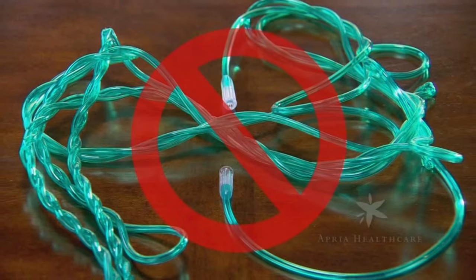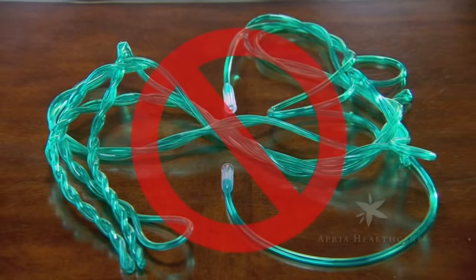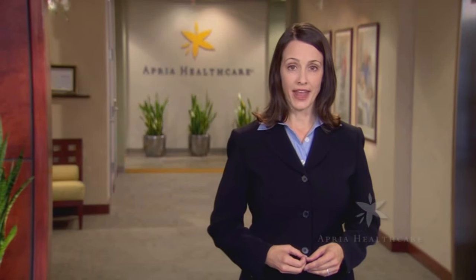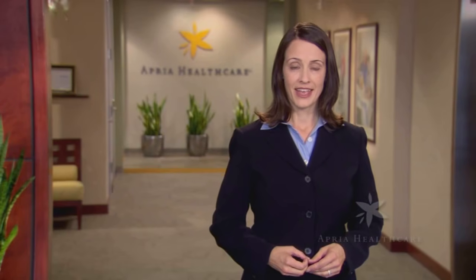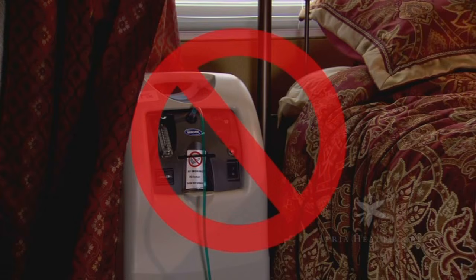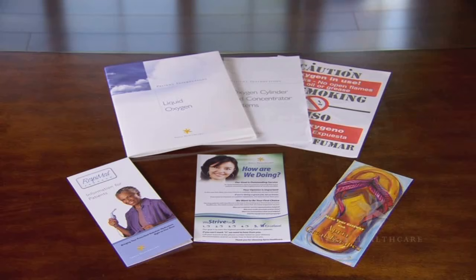If the flow seems diminished, check to see if the tubing has been kinked, punctured, or there are loose connections. Check connections and replace tubing and cannula as needed. If the airflow to the unit is restricted, move the unit away from drapes or place it in an area that is not cluttered. See your patient instruction manual for advice about where to place your concentrator in your home.